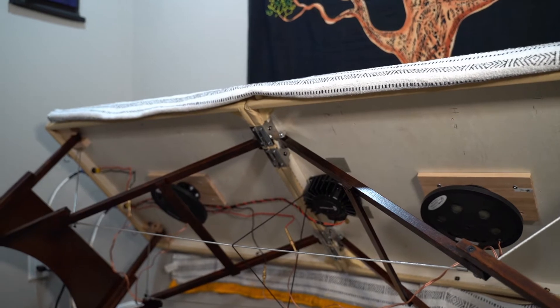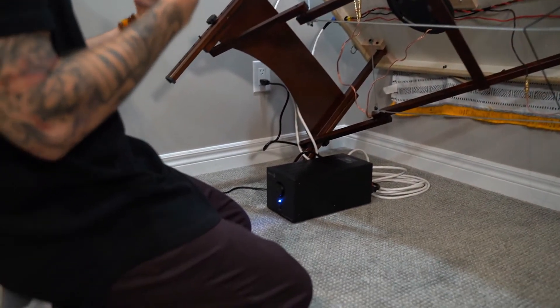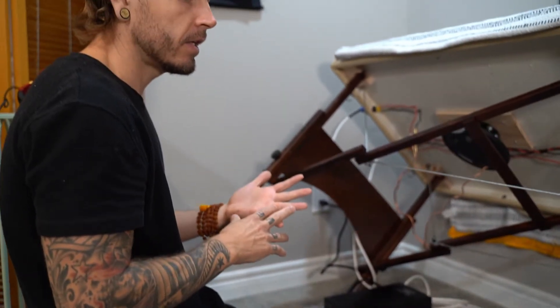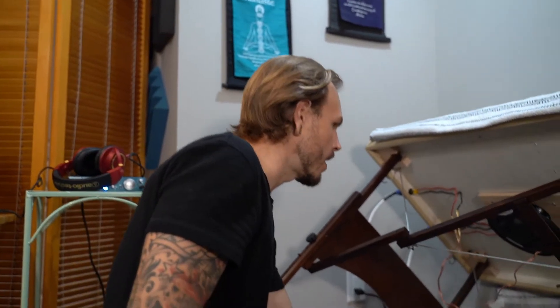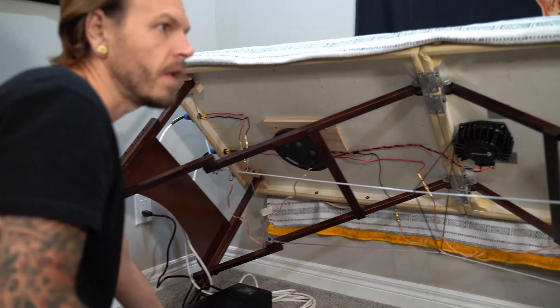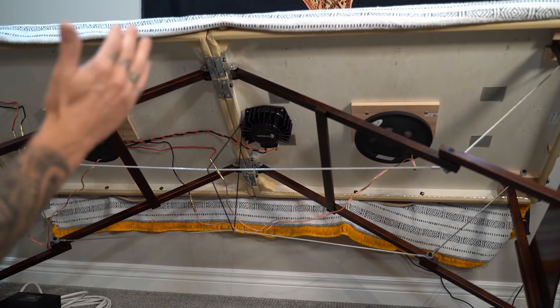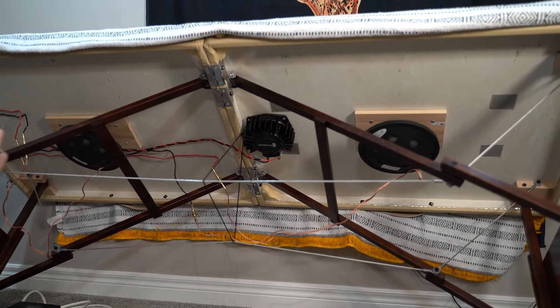We have an amplifier powering these. What we do is we take a meditation, sound, or frequency that your body needs, and it plays through our computer, comes through the amplifier — and if we turn up the amplifier you can begin to hear the speakers. You're not hearing the higher ends of the frequencies because these have a frequency pass on them and can only play the lower ends of the music.